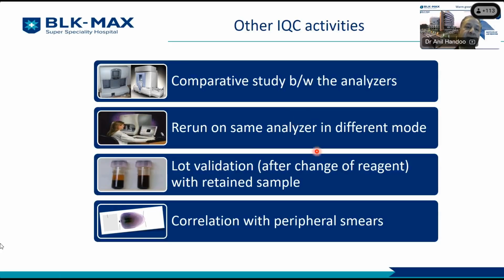What we need to do is make sure that at defined intervals, the difference between the two modes is also checked on a regular basis. The reason you do that is that sometimes one of the modes can have increased proteinaceous deposits and may not be aspirating the right amount of material. And we need to keep track of that as well.